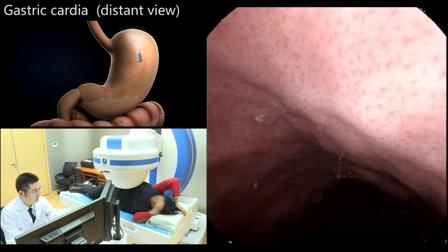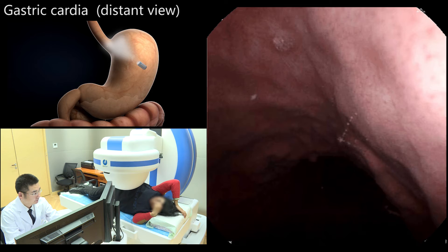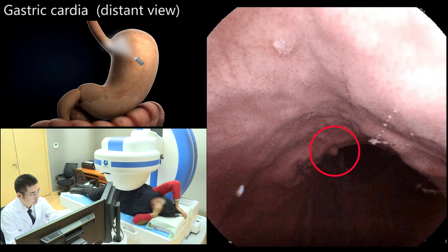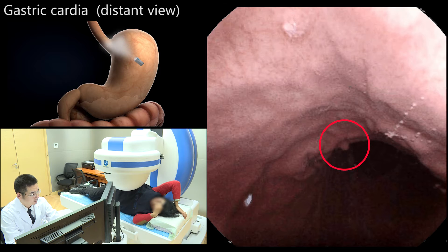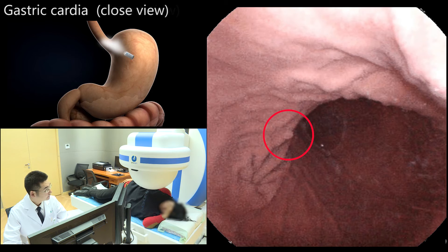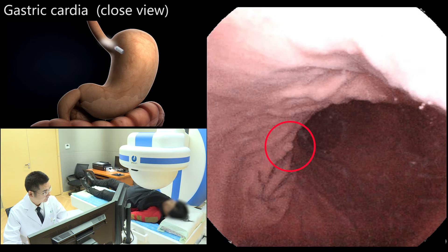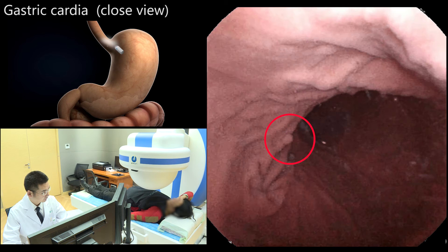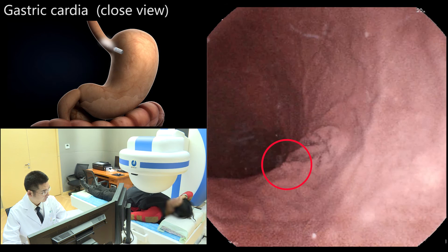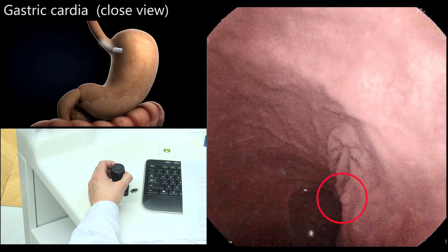With the patient in the left lateral decubitus position, the capsule was lifted with the camera oriented vertically upward to observe the cardia at a distance. A polyp was found near the cardia. The patient was then placed in the supine position; the magnetic ball was lowered and the camera oriented upwards to obtain a near view of the gastric cardia. The capsule was rotated 360 degrees to observe the polyp in greater detail.